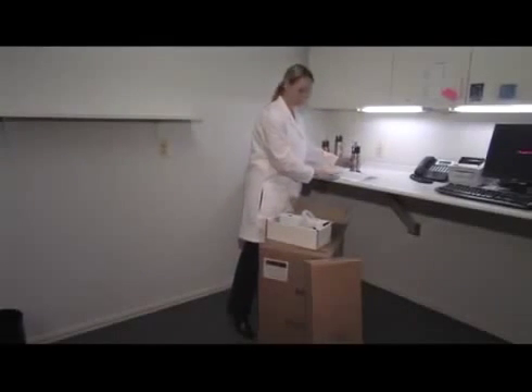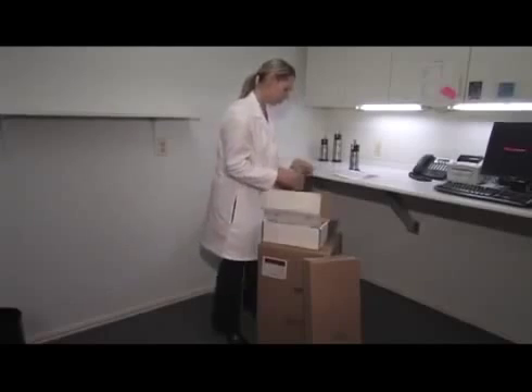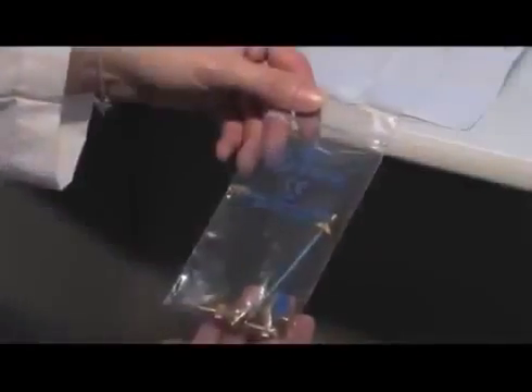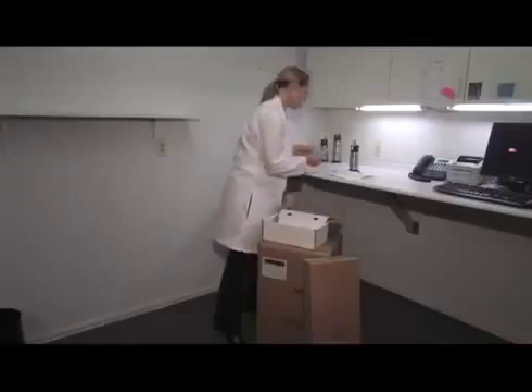Check to make sure all accessories are located in the boxes. The cryoplate — the four-hole clear plastic disc — confines the freeze just to the lesion. The set of spray tip apertures are labeled A, B, C, and D. Also included is the instructional DVD.